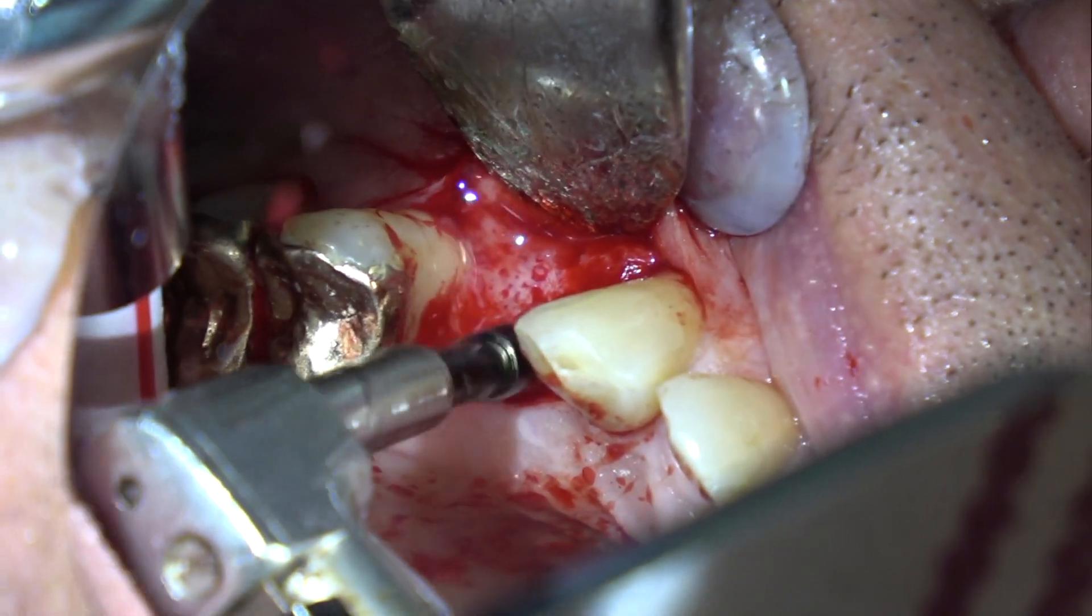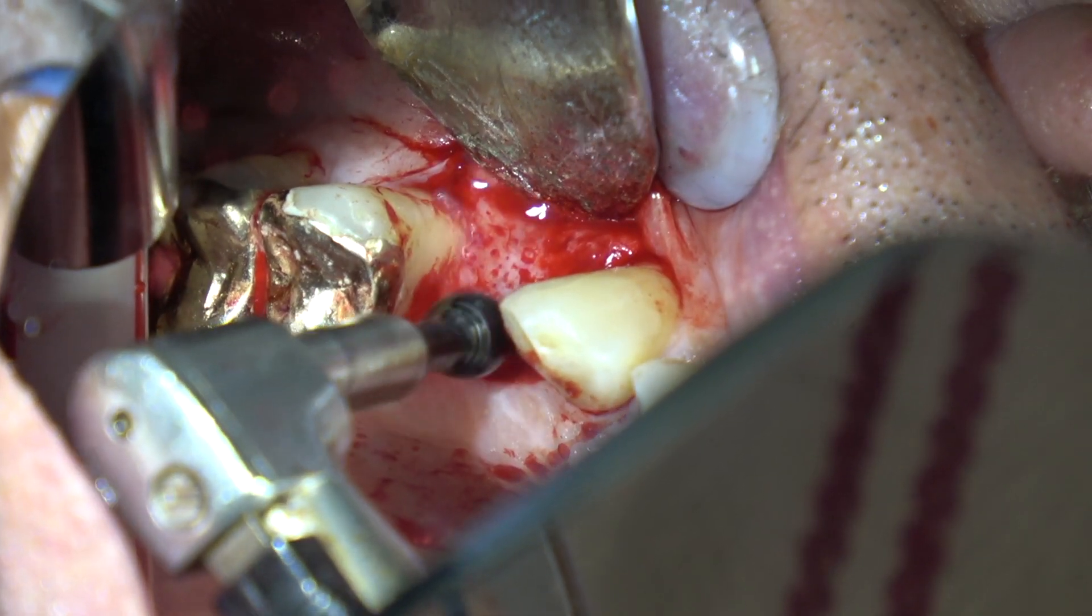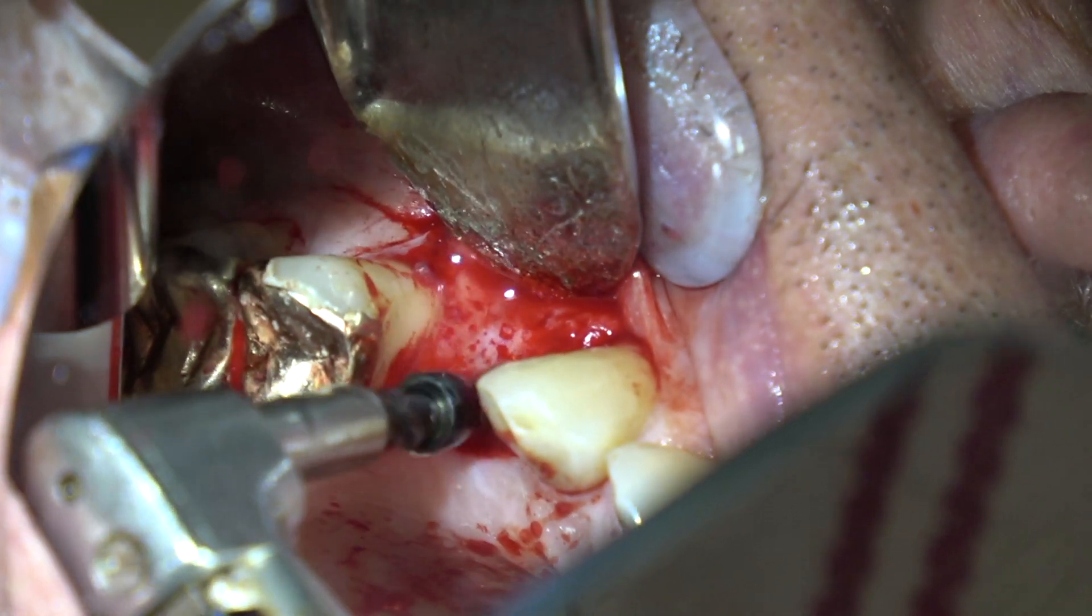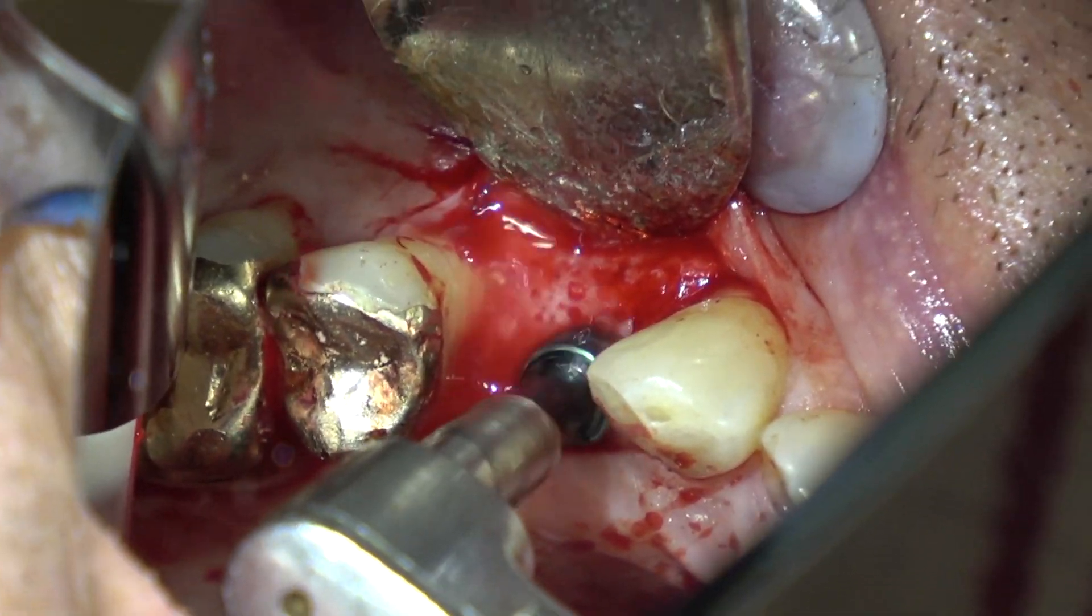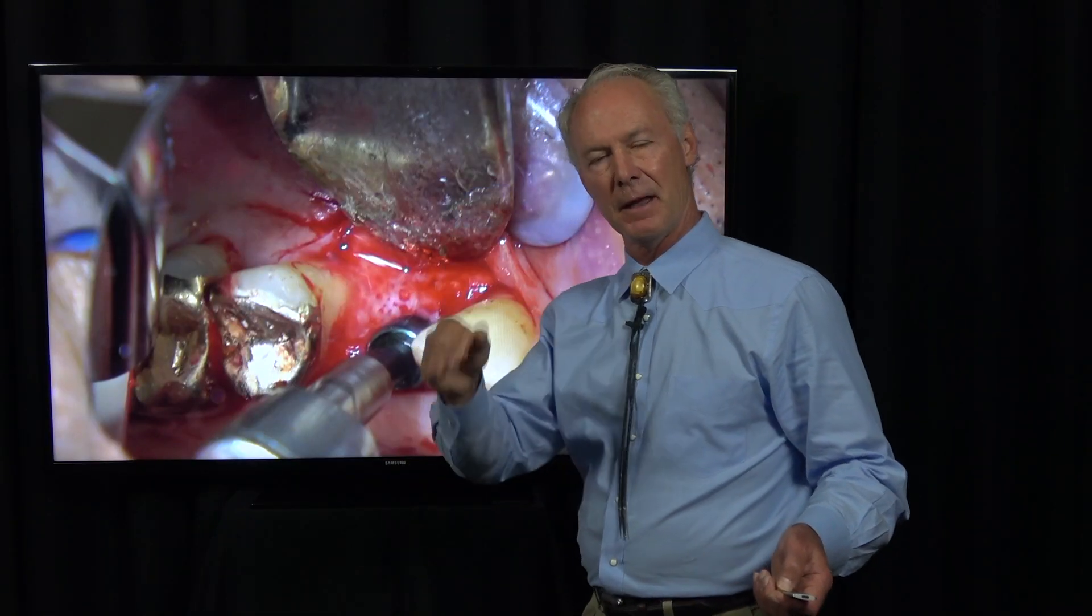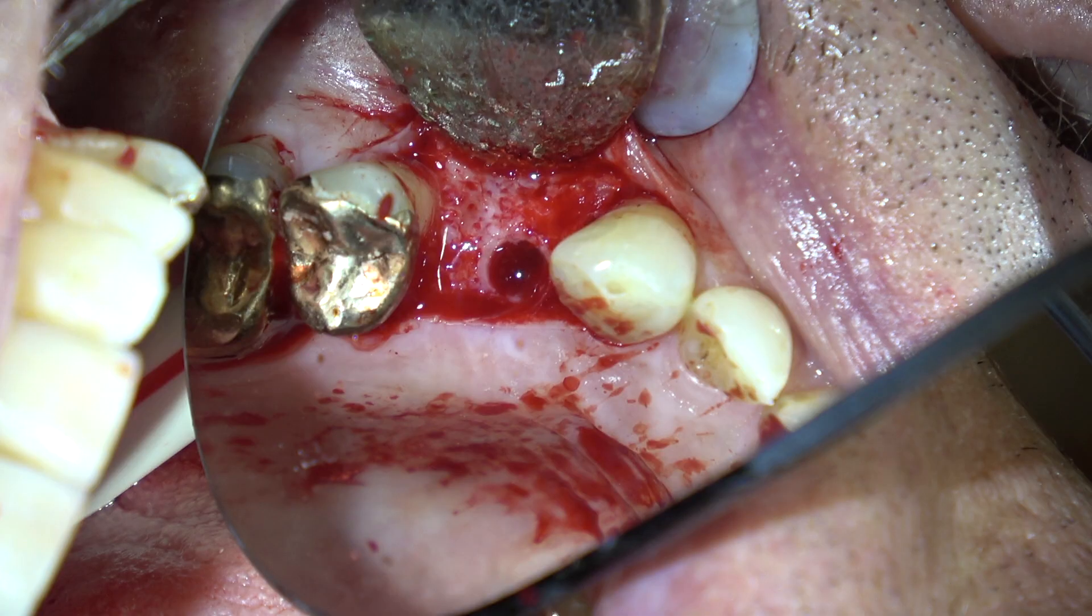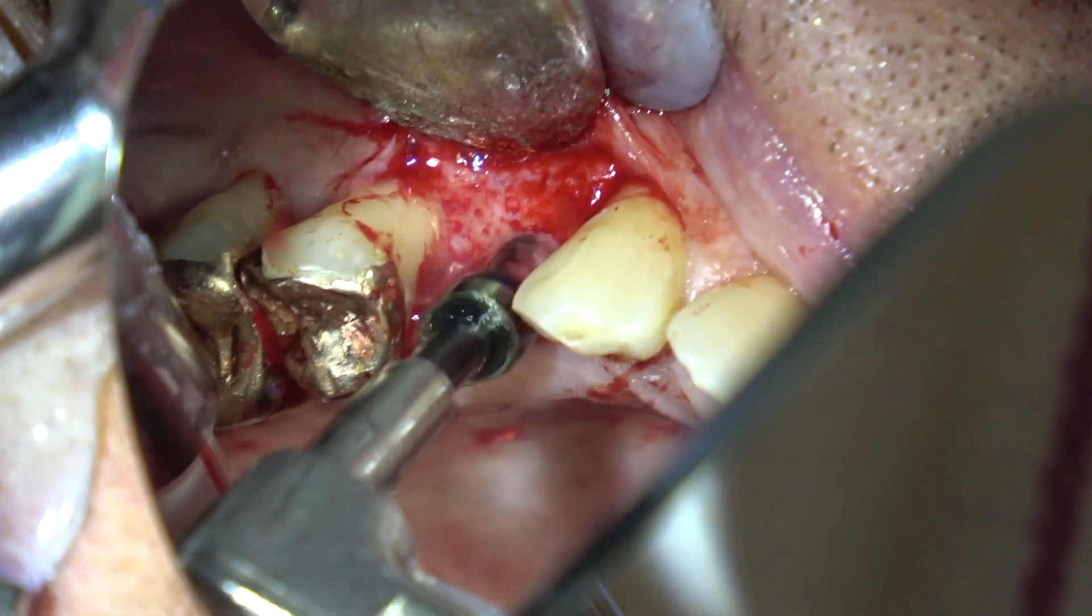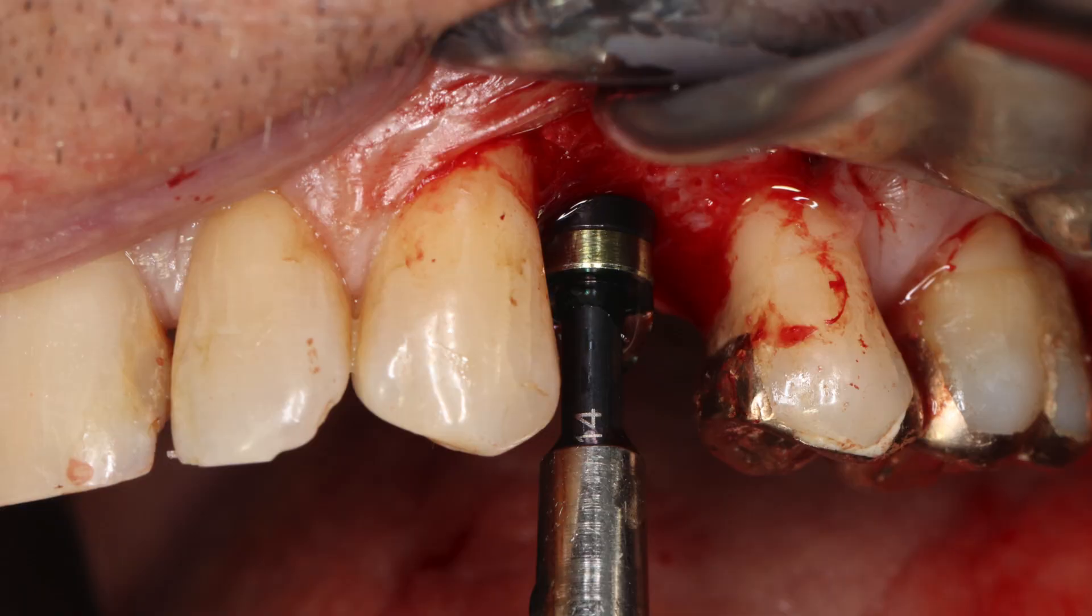See, it's got the shoulder so you just go straight and stop. Once you've determined your length—this is 14mm—it takes under five minutes to get to the terminal drill. Take a radiograph with the drill in the osteotomy about every two drills to ensure alignment remains correct. Now we're to the 4.1, and it's just boom boom boom, so easy. The shoulder stops it.